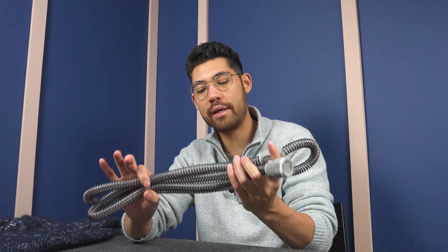Hey there, my name is Tristan from cpapstore.ca. Today we're looking at heated tubing — this is going to be the heated tubing from ResMed, the Climate Line Air. We're going to be looking at the AirSense 11 Climate Line Air in this video, but this will be applicable to the AirSense 10 as well.